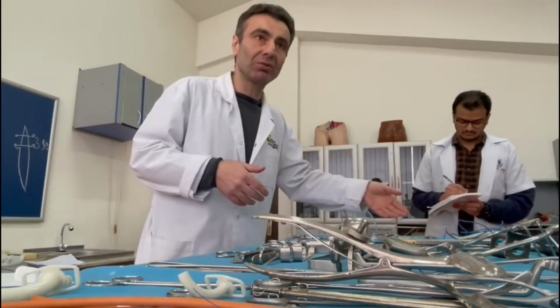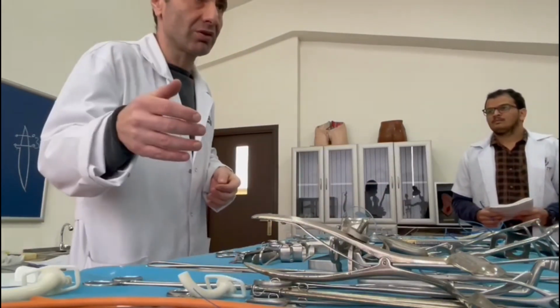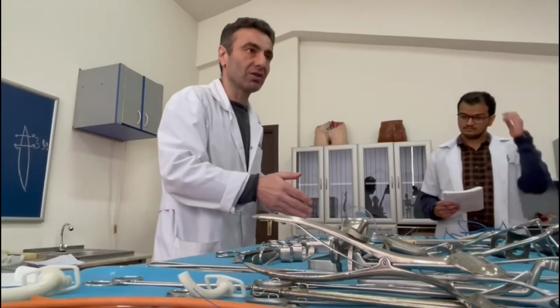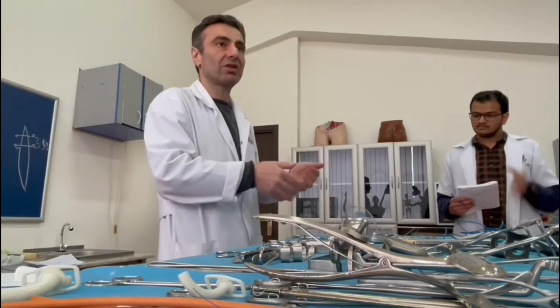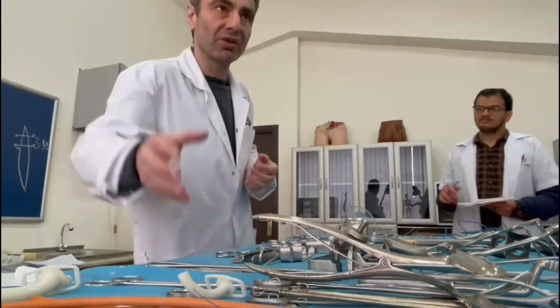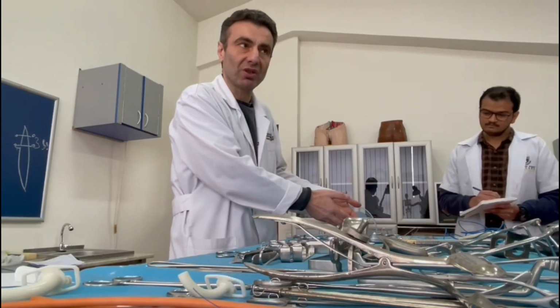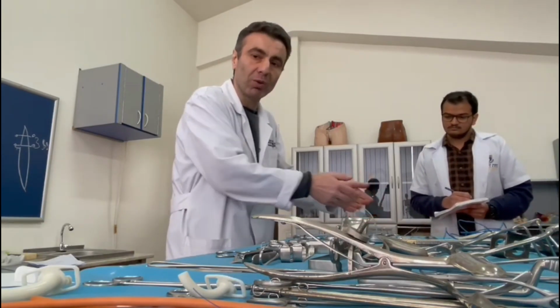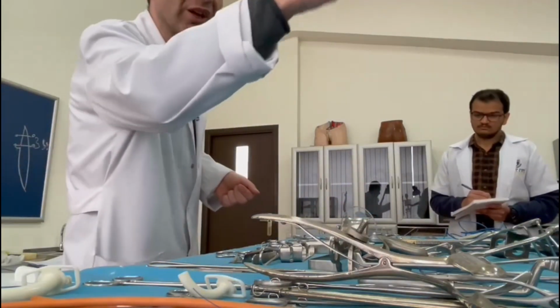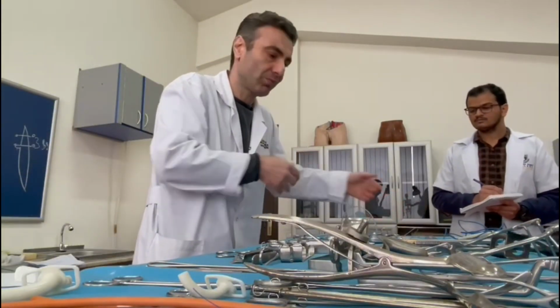Cutting, as I said 2 minutes before, we can use during the first stage and during the second stage. For example, during surgical access, incision. During the second stage, for example, I must make a resection of the stomach, cutting part of the stomach and removing it. Of course, for that purpose, I need the instrument for disconnection. We don't use the first group of instruments for the last stage, suturing of the tissues. But during the first and second stage, we can use them.